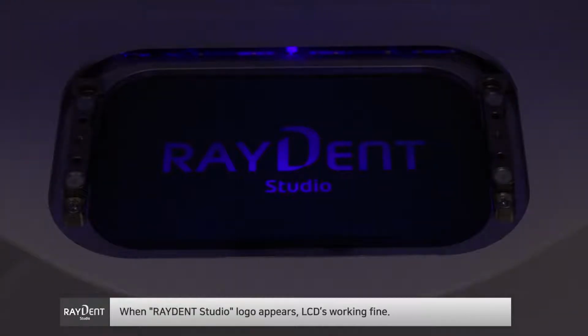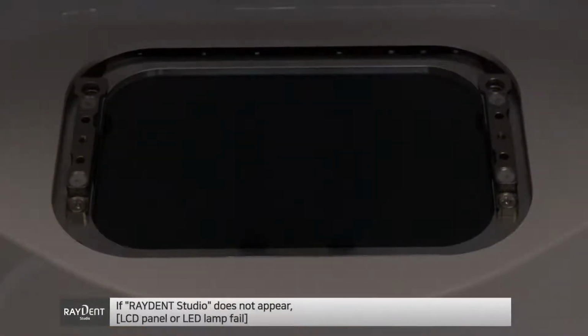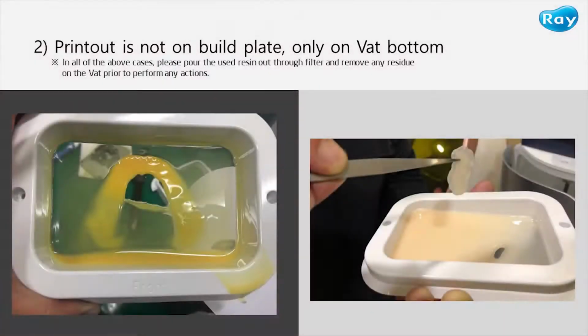If the logo is projected, both LCD and LED are operating fine. If the projected image is not a logo, but a broken image, there is a problem with the LCD. If nothing's projected, it could be either LCD or LED malfunctioning. For both of these cases, please contact customer support for the replacement.